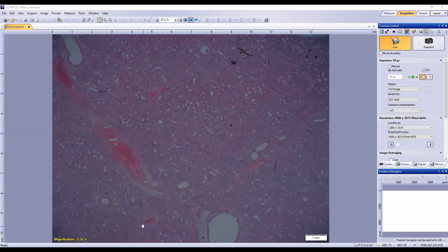Tuberculosis and yeah, TB. Yep. And fungal. Fungal, yep. Parasites. Yep, parasites. Distemper will do it as well. Yeah, mycobacterium, fungal. Yeah, good.